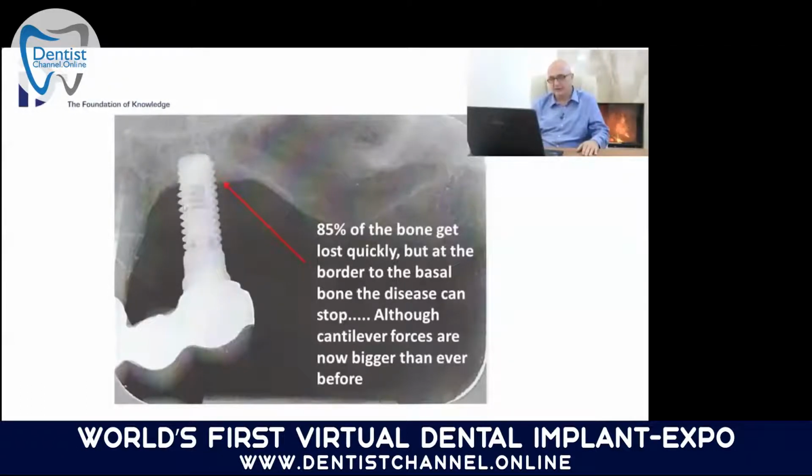First of all, in our textbooks, when we learn about peri-implantitis and why this happens, we are kind of told that because this implant is subjected to lateral force from chewing, the forces on this collar are too high, and from this the bone disappears.